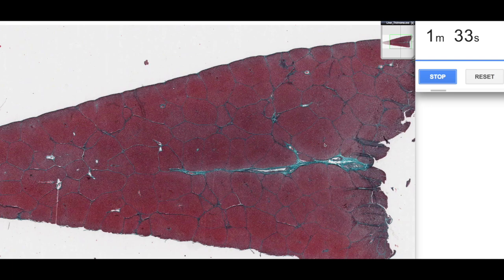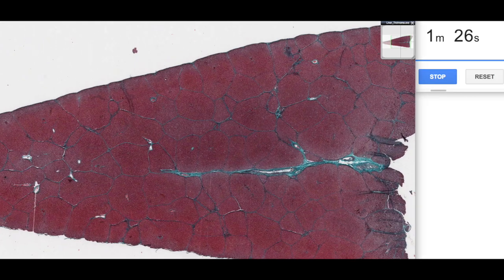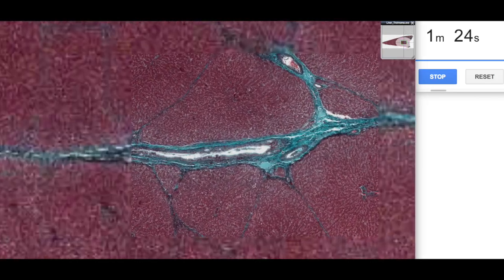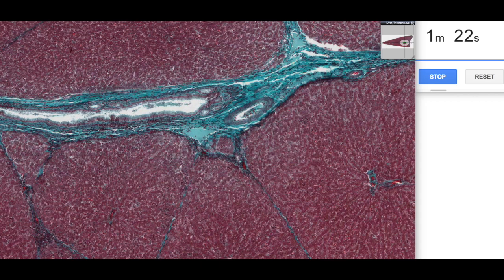So we can actually see evidence of this dual blood supply when we have a look at the connective tissue or the stroma of the liver. So if we zoom in to one of these areas, this area here is often referred to as the portal region or the portal triad because it usually contains at least three different structures.